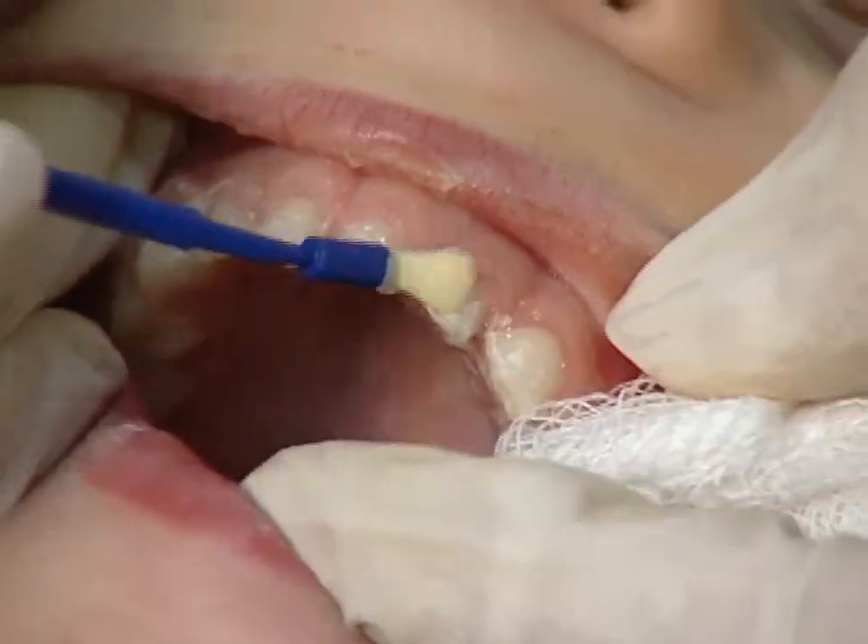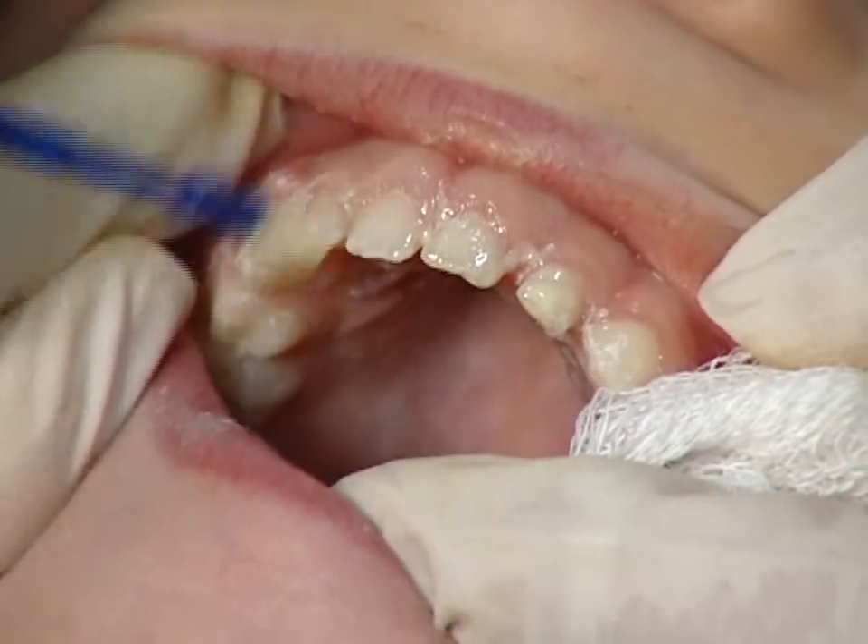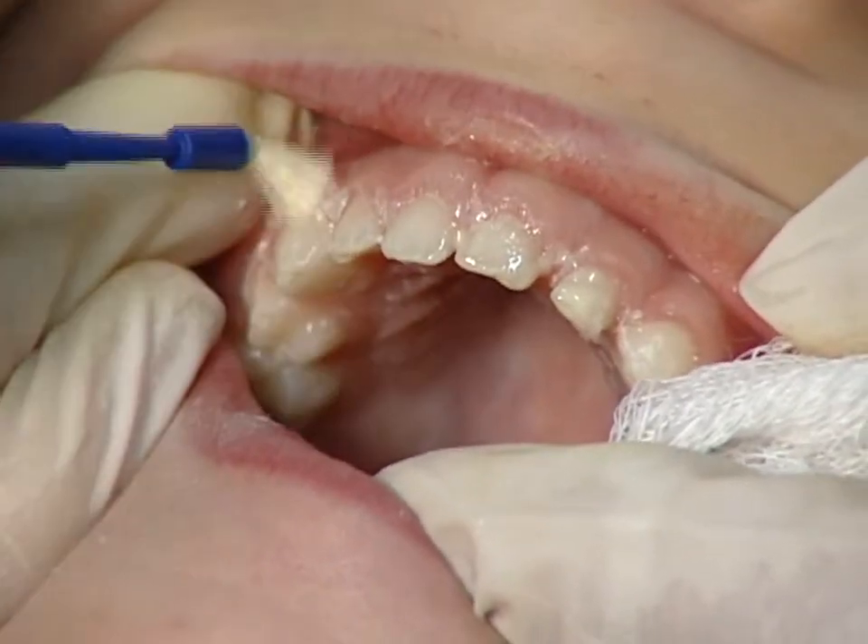Paint the upper incisors last so that you do not accidentally wipe off the fluoride varnish as you work in the back of the mouth.